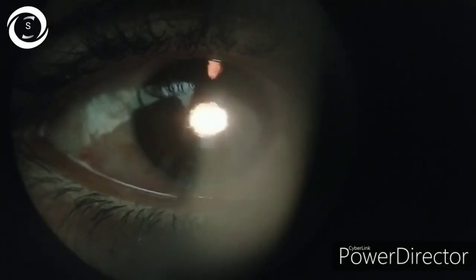Here in an angle closure glaucoma case, a peripheral iridotomy has been done. You can see that while passing the small slit of light into the pupil at 12 o'clock, the peripheral iridotomy or iridectomy has been illuminated. So it not only tells you whether it is patent or not, but also its exact location.